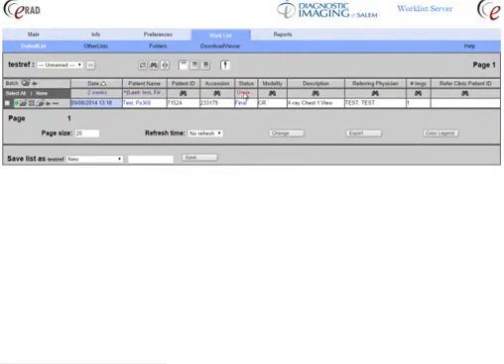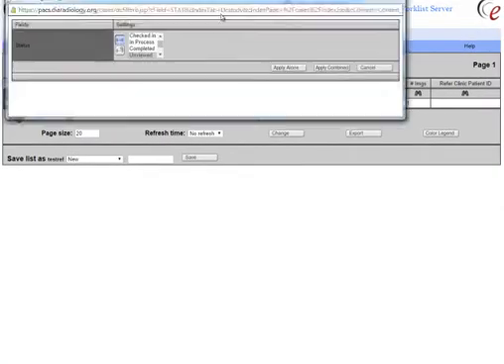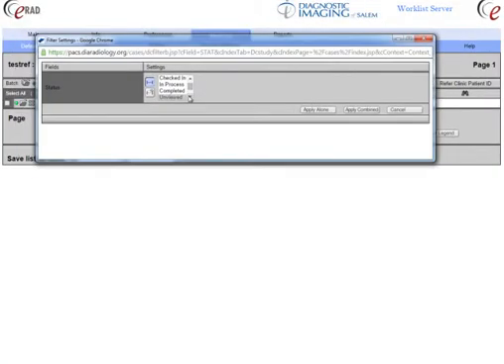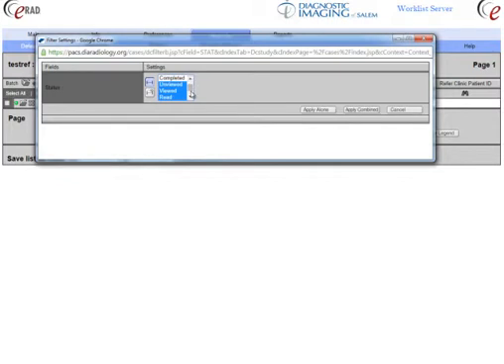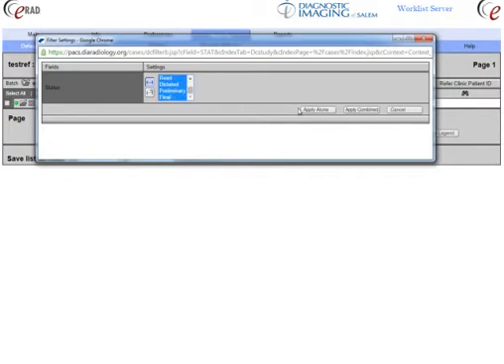The status filter is set from Unview all the way through Final. This is probably the best bet for a referring office, in that anything before the Unview step could mean the technologist has not even completed the exam. With the Ordered status you're going to see all future ordered exams in the system, which makes a cluttered list.